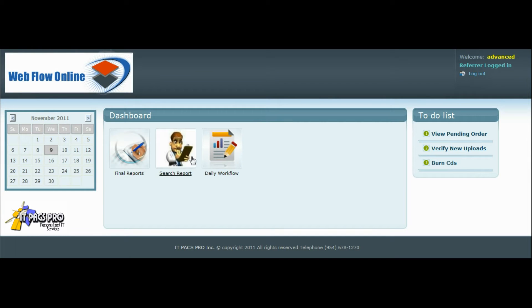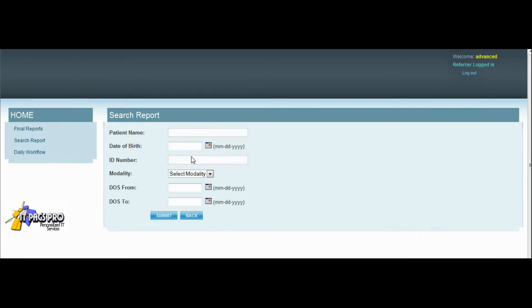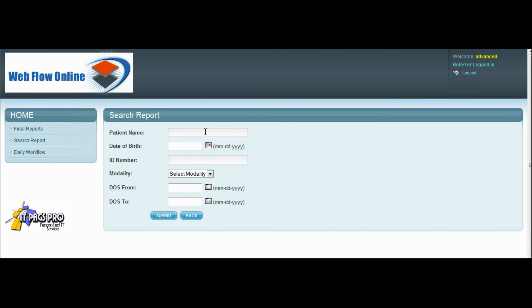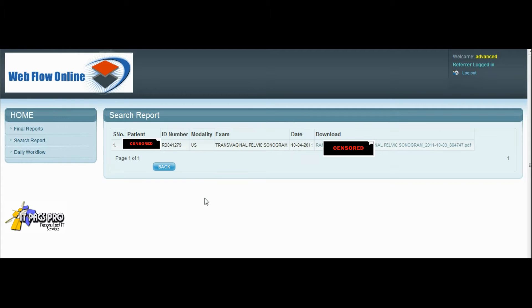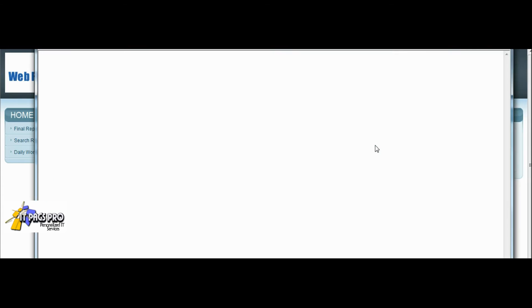The referring physician also has the ability to search for reports by name, by ID number, by modality, or a date of service range. The results will display here and a link will be presented to download the PDF.